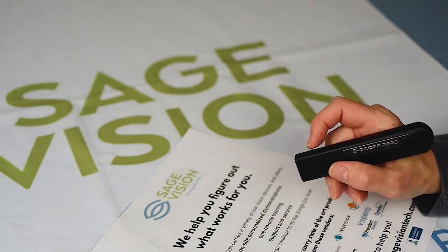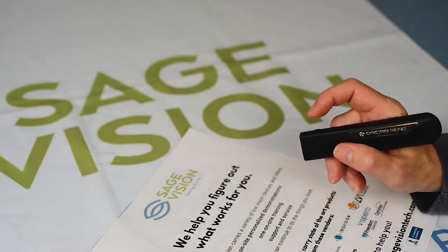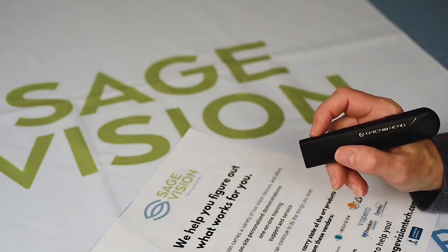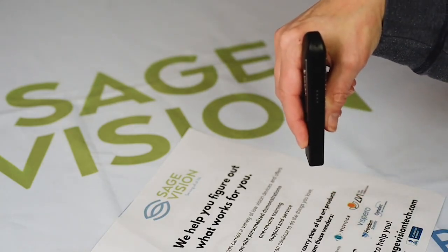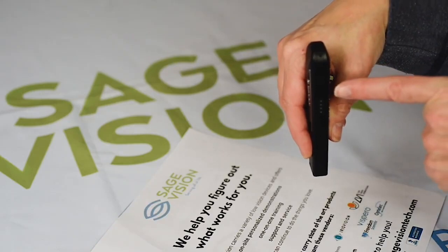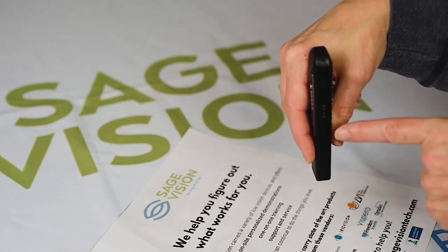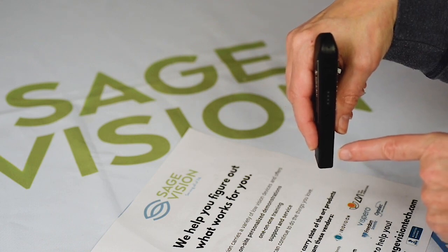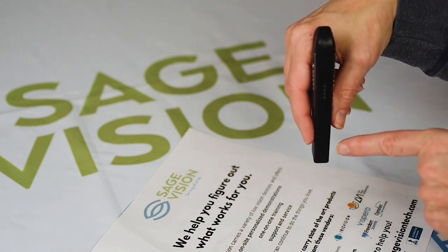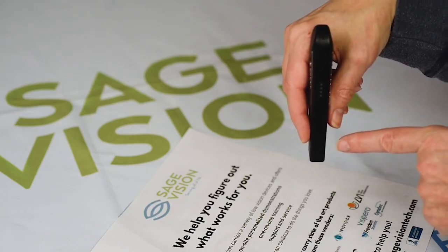The OrCam Read is lightweight and works like a pen. All you need to do is hold it in your hand and work these buttons — there are four of them: on-off, increase, decrease volume, and this button right here is how the camera takes a picture of what it's going to read aloud to you. Very simple to use.